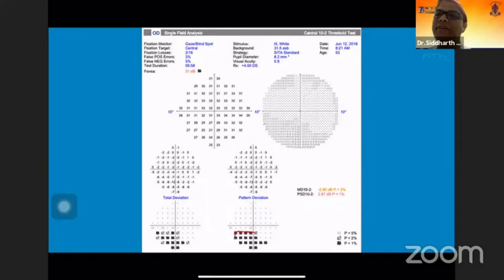In fact, you are likely to see a slope, so denser points centrally with less dense points in the periphery, whereas this scotoma is very strictly localized. It is not an absolute scotoma, but if you see what is called the slopes of the scotoma, the areas adjoining the defect are all completely normal.